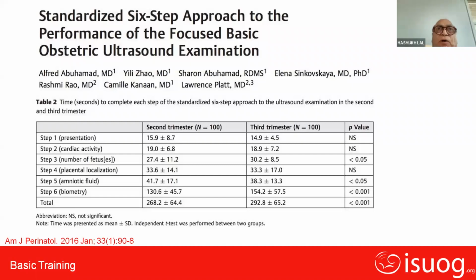if we follow a systematic approach like the 6-step approach, the time taken to complete a scan will be minimal. If you are all gynecologists, with minimum steps, if you do a surgery, you are perfect. So if you use minimum steps to complete an ultrasound, you are an expert in ultrasound. Ashok sir is an expert.